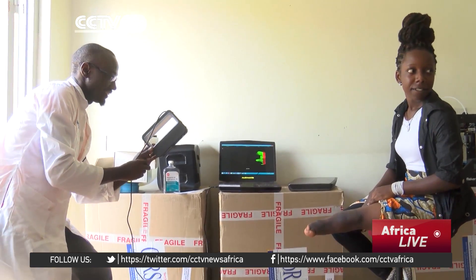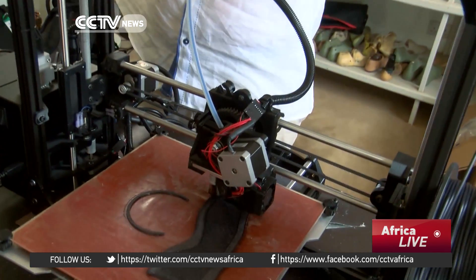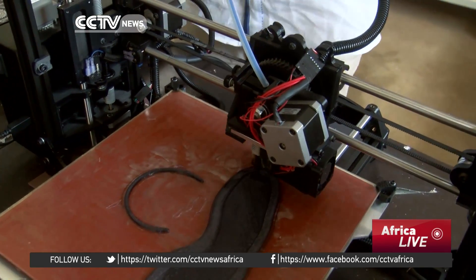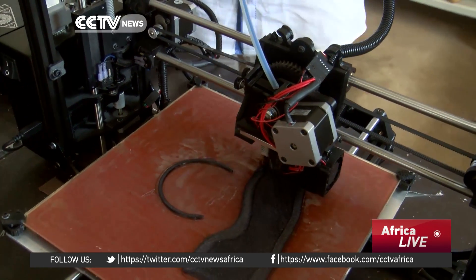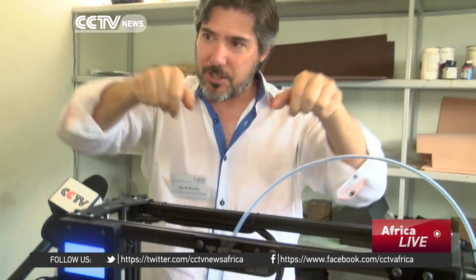Scanning takes place before the digital limb is printed. The printing process works by depositing plastic in layers, one layer at a time — it moves up, adding another layer, building a 3D object. It's similar to taking clay and making a spiral, building a pot that way — 3D printers work in exactly the same way.